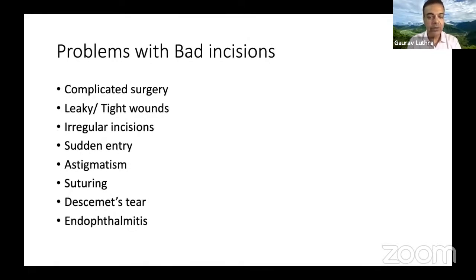Then, if you had poor keratomes, and I've seen that happen. I've gone through post-graduation. I've gone through the situations where, for purposes of economy, we would reuse our blades after autoclaving them. So I think over the time, I realized that no compromises on my keratomes, even if you end up spending a little extra money and charging a little more from your patients, you really need good keratomes for yourself. So no irregular incisions, sudden entries, and I'll show you a couple of videos of what can happen with that.